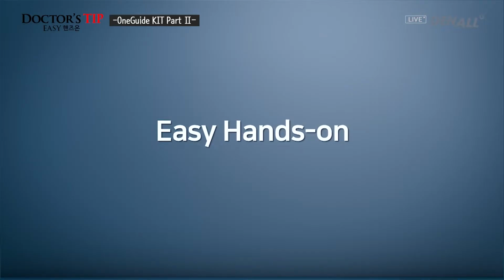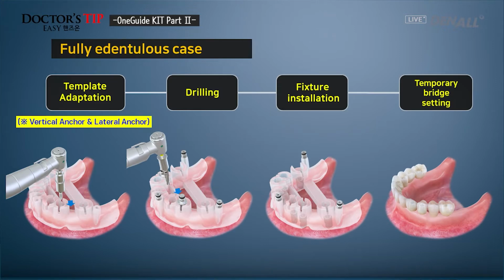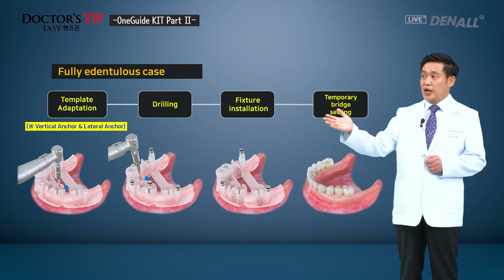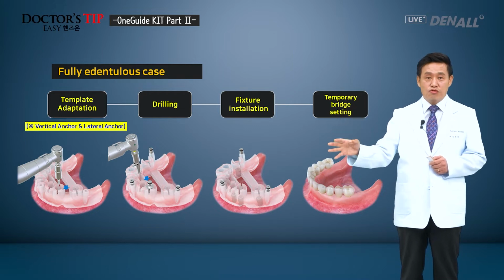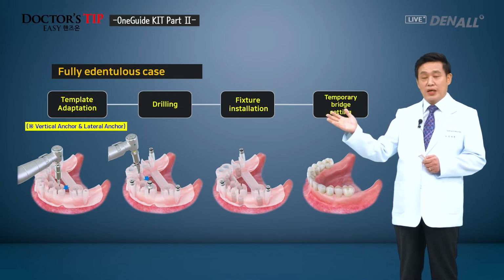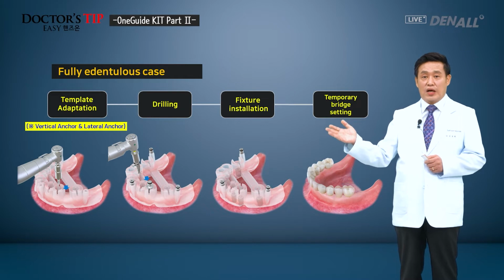Next is about easy hands-on. As mentioned earlier, vertical anchor and lateral anchor is going to be used. In the case of edentulous cases, there can be a bit of deviation when you adapt to templates. So to prevent this, lateral and vertical anchors are used to adapt the template firmly, and drilling is going to be done to place the implant.